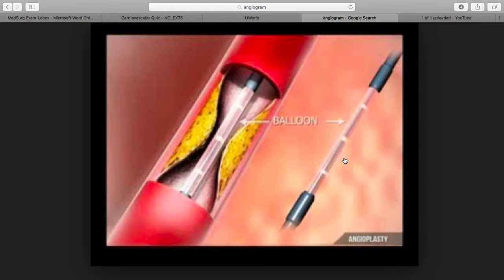You need to talk to the patient about the dye, and how it's going to speed through his circulatory system. We're going to place this patient on NPO. Stop metformin if the patient is on metformin. Check for shellfish allergies, because we're going to be flushing iodine through. Since we're using iodine, we have to check the perfusion of the kidneys by checking the BUN, creatinine, as well as the GFR, glomerular filtration rate.